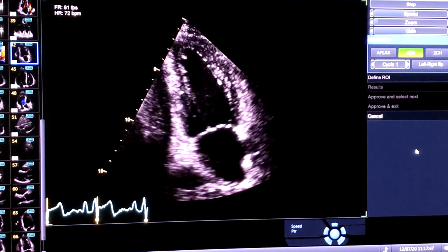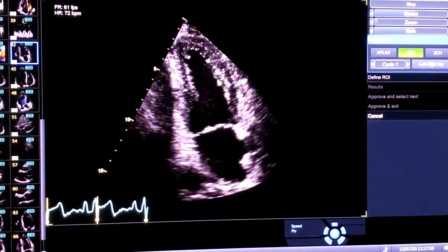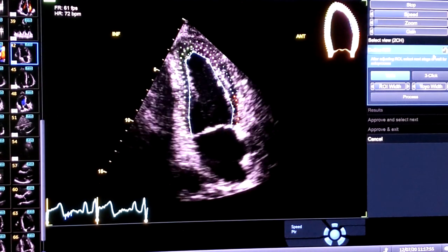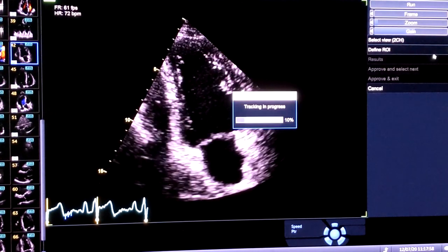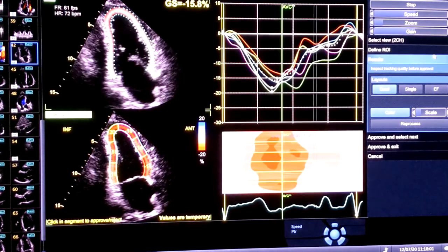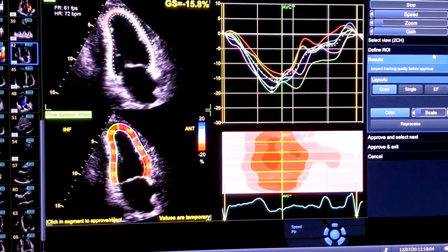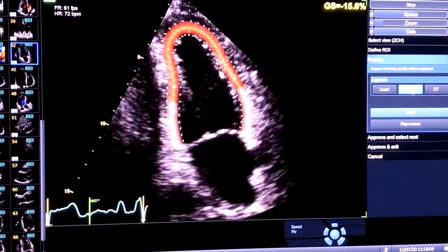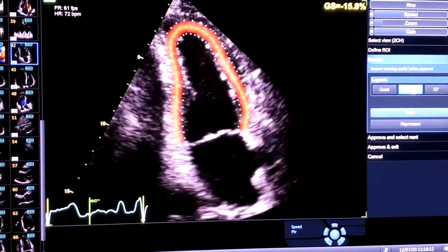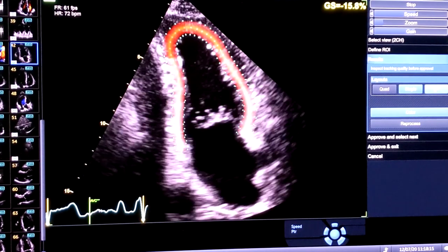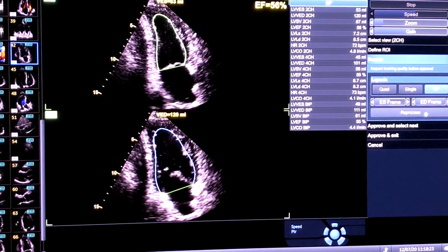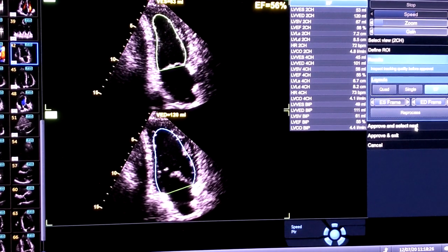Select the correct view — in this case the apical two-chamber view. I'm happy with the tracking; you can either click process or it will automatically process. You will get the longitudinal strain of the apical two-chamber view. Click single to analyze one image, or click AFI to obtain the biplane ejection fraction and biplane diastolic and systolic volumes. When ready, click approve and select next to go to the last view.